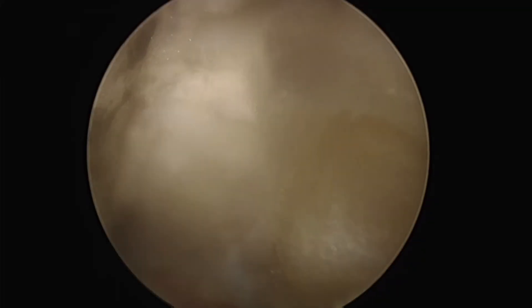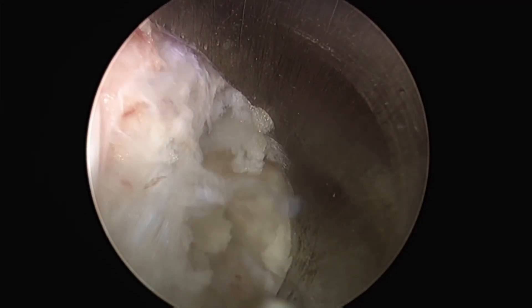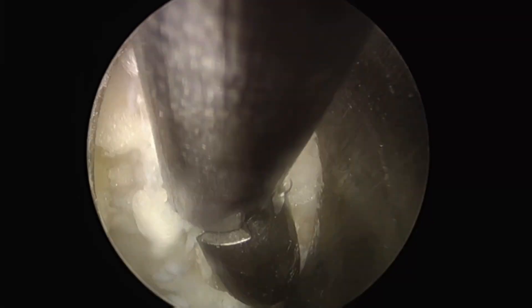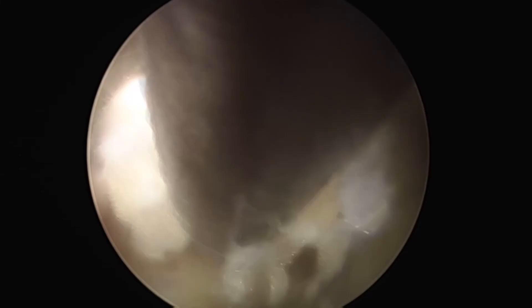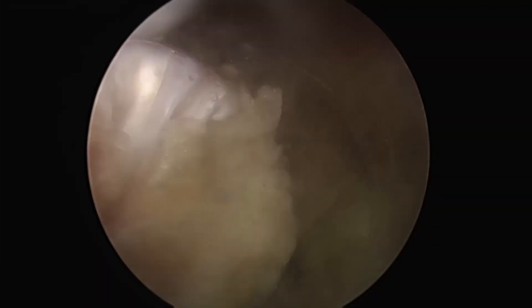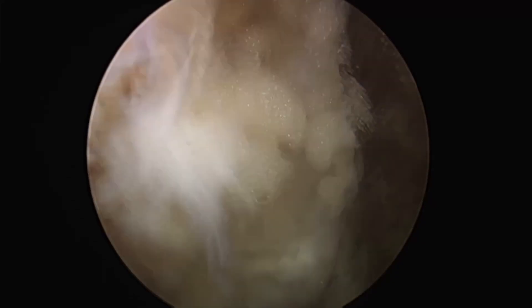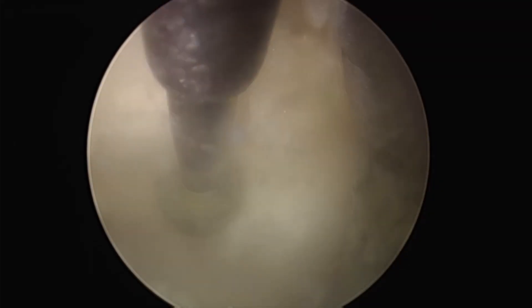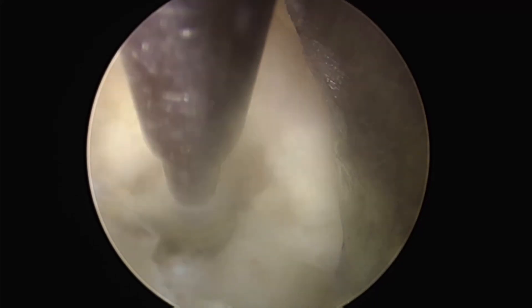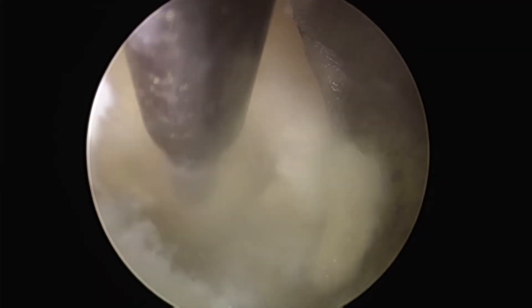The scope is then tilted toward the midline, and the superficial layer of the ligamentum flavum is excised. A punch is used to remove the superficial layer; it is recommended to perform this as close to the midline as possible. Before removing the deep layer, the attachment site of the ligamentum flavum and the attachment of the superior articular process are drilled. The reason for this will be explained later.